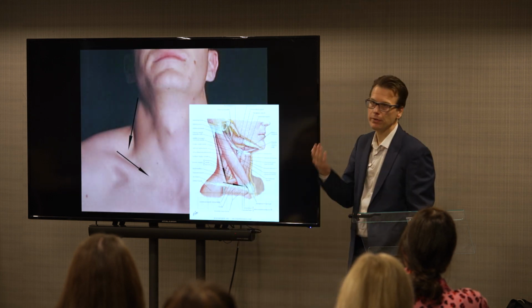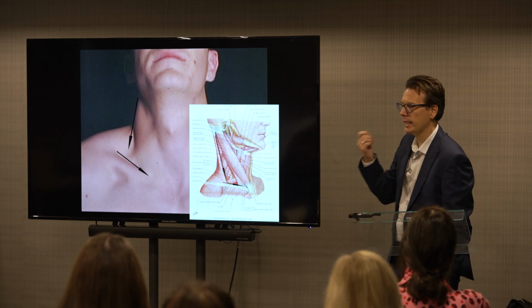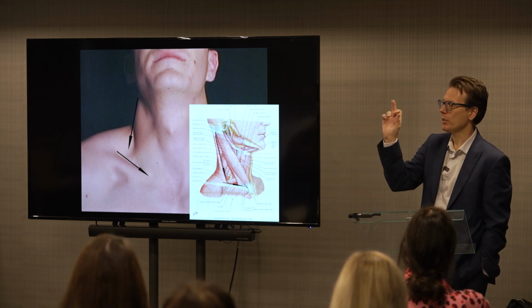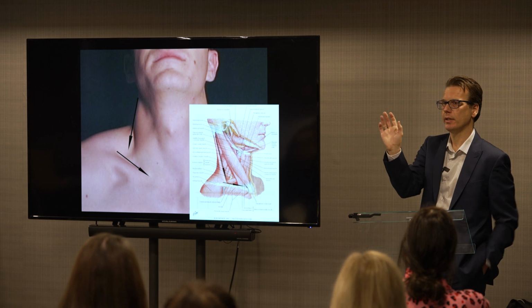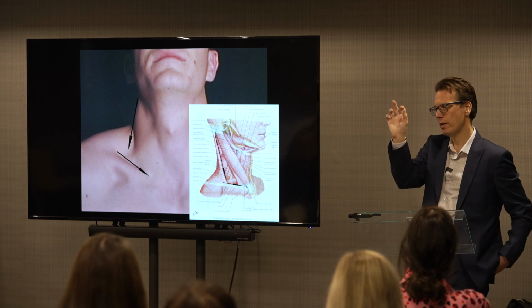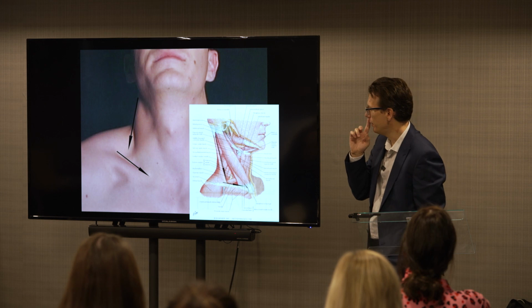So once we've done 2 through to 4, we then want to look at the posterior triangle, so your level 5A and B. And again, it's a similar process. So you want to have the posterior border of the sternocleidomastoid muscle and the anterior border of trapezius, either side of your image, and you're just driving through that posterior cervical space fat as you go down the neck looking for lymph nodes.